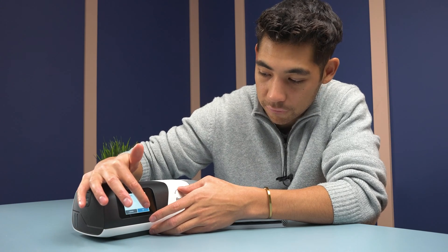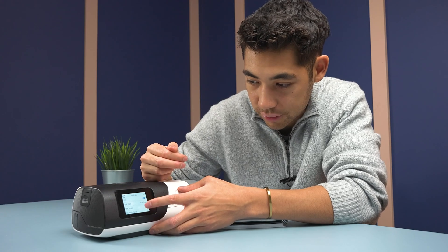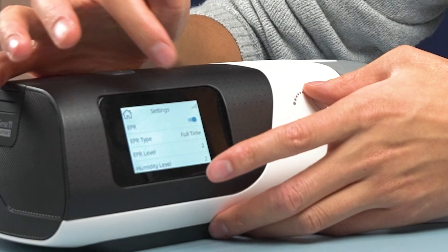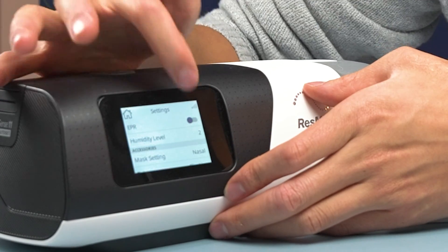Here we're going to select full time. The EPR level is currently set at two — you can choose one, two, or three. If you want to turn it off, you can turn it off right there.